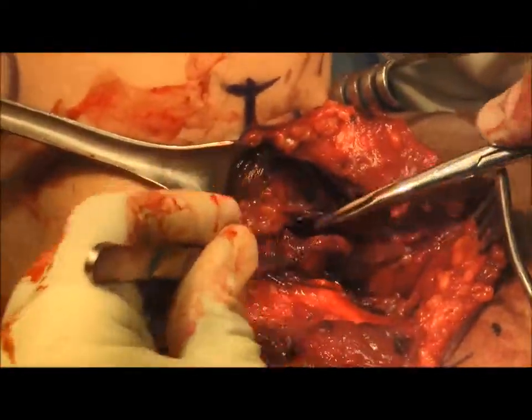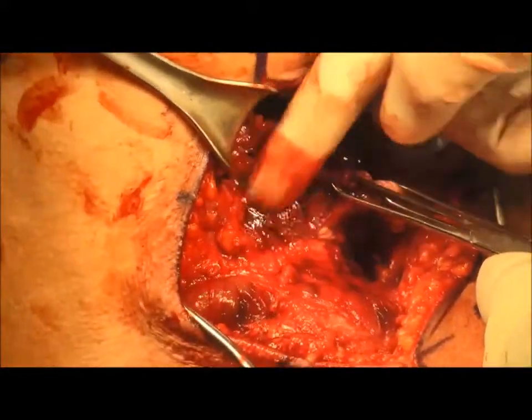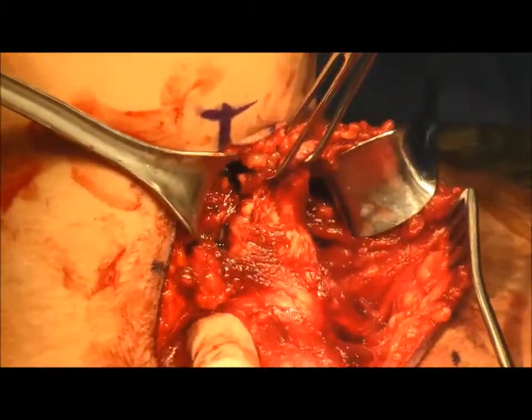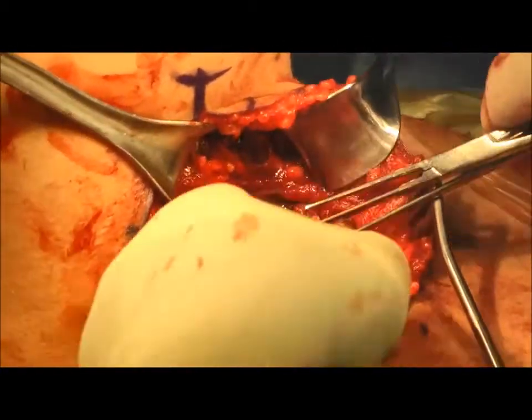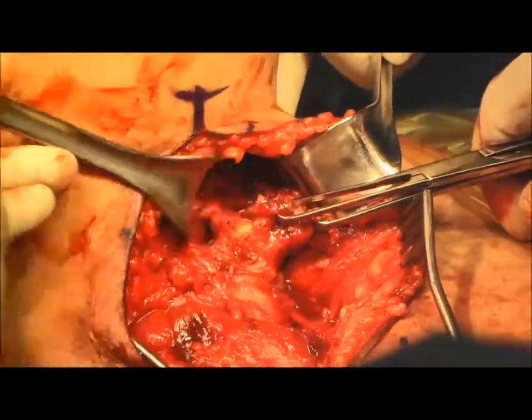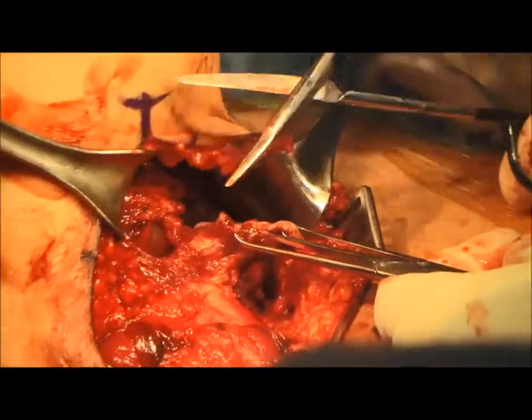Next, we mobilize the tendon. Allis clamps are placed on the tendon to allow for tension, as the ruptured tendon is mobilized with blunt dissection until it can be readily approximated back to its humeral footprint. Some sharp dissection is used to dissect adherent fibrous tissue.